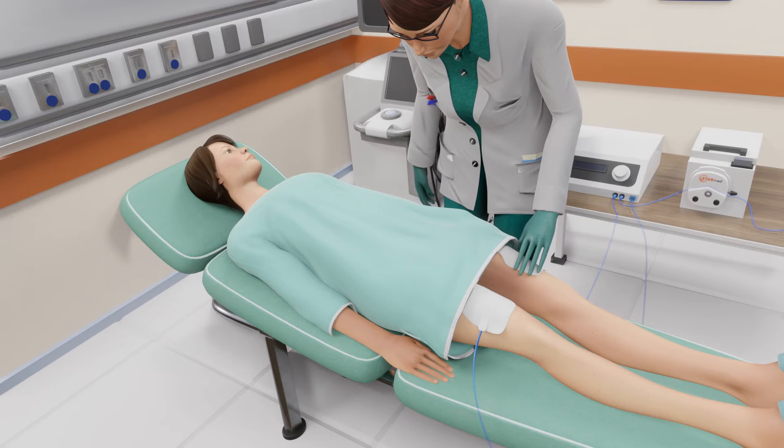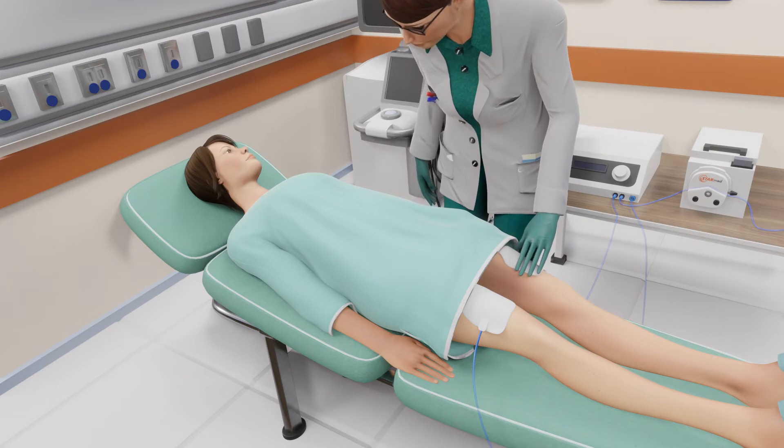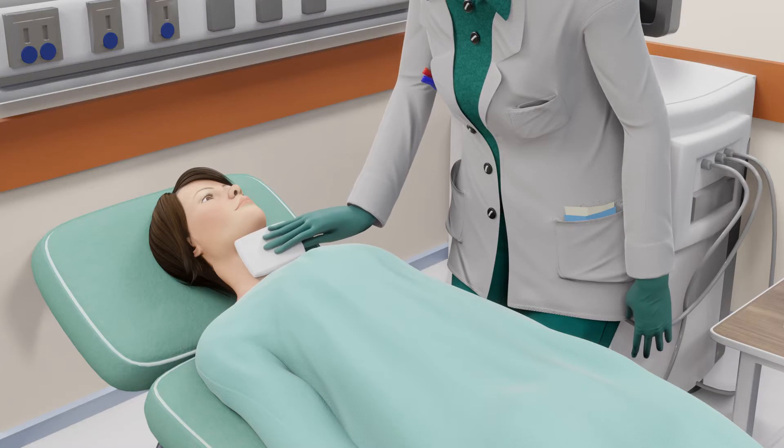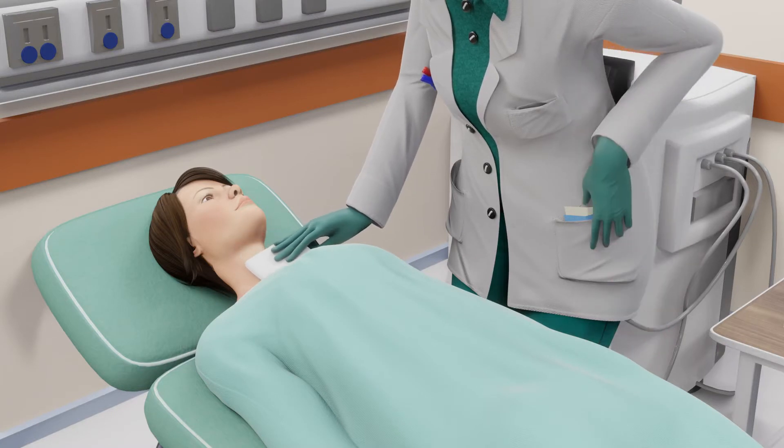Two grounding pads will be placed on your thighs. Your thighs may be shaved if necessary. Your neck will then be cleaned and disinfected to avoid infection.